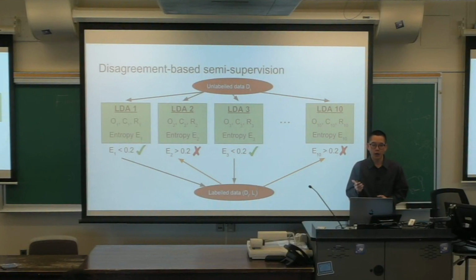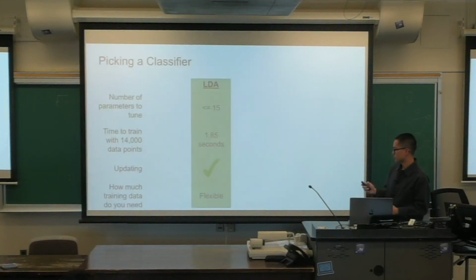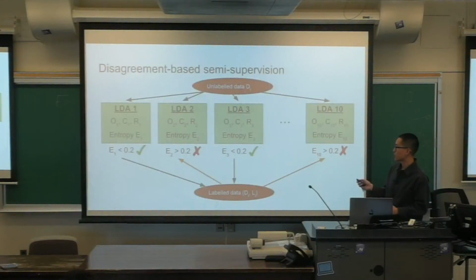Before, we only had one classifier, but now we have an ensemble of classifiers. The key point is that each classifier is using a randomly sampled subset of the data modalities.